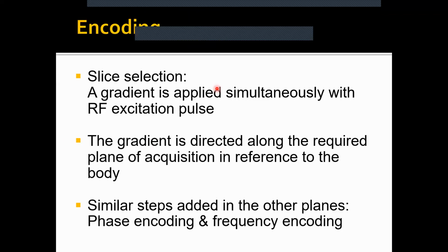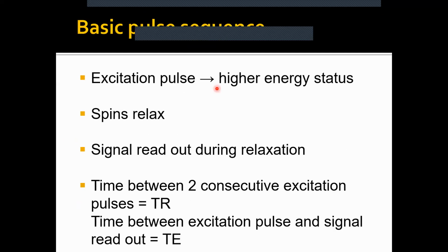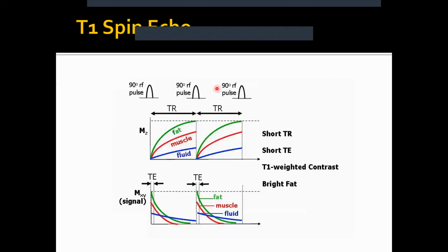Now I'm going to skim over this very briefly, because this was skimmed over very briefly in the lecture. But the key thing is I want you to look at this graph. In a T1 weighted image, you're going to send the pulse, and then very quickly measure the amount of energy that's sent out. The reason is that fat and muscle protons relax very quickly compared to fluid.